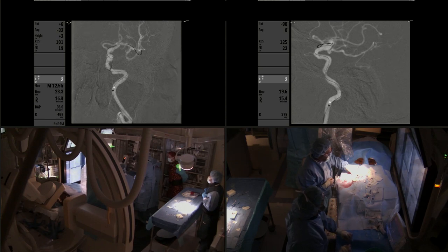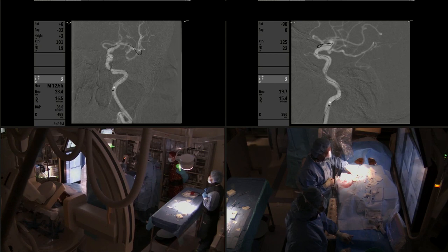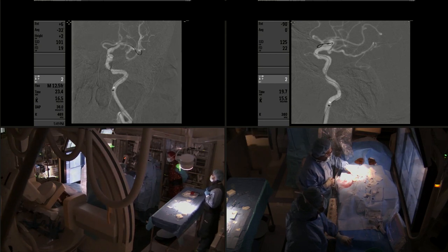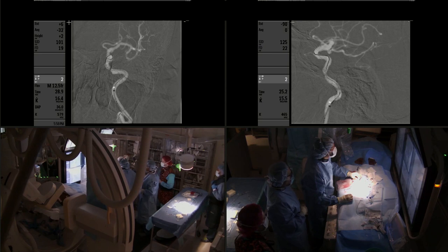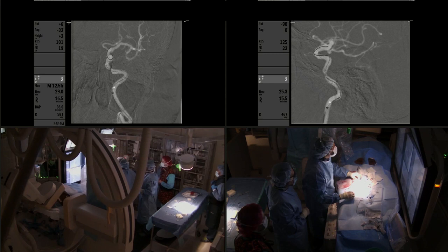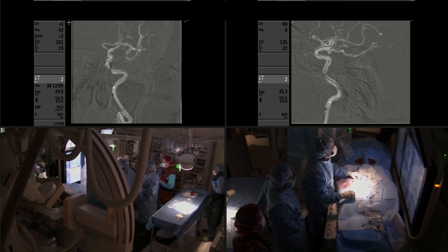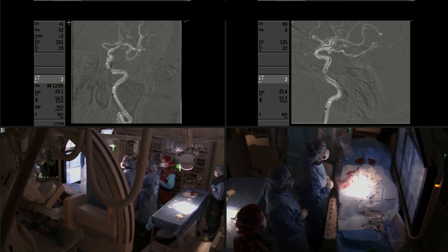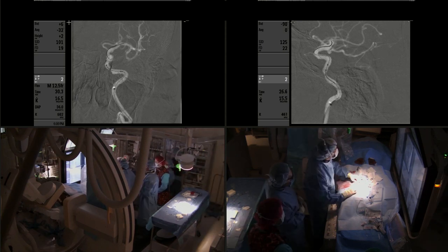Now we're going to go ahead and advance our stent. We use the long exchange system using the 300 centimeter microwire. That is one of the main reasons why it is important to have good distal access with the guiding sheath and good support.